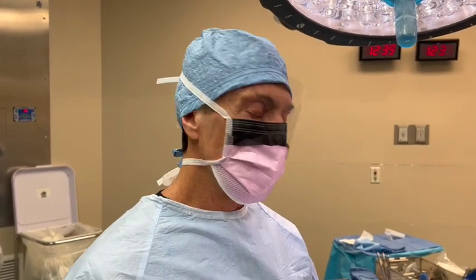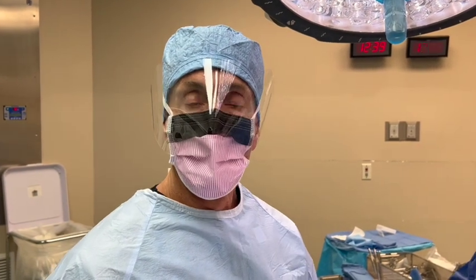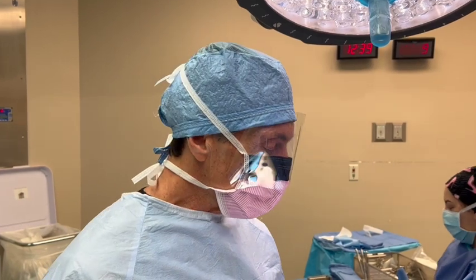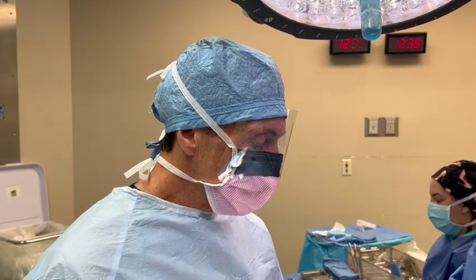Hi, it's Dr. Moore again, and we're going to try a new product today from Osseo. In the earlier cases I was using their bone pen, it's a natural product that they make for fixation.